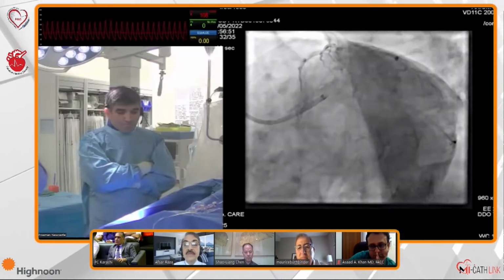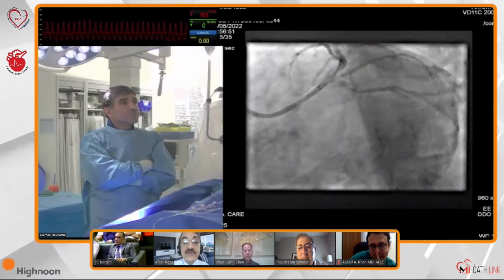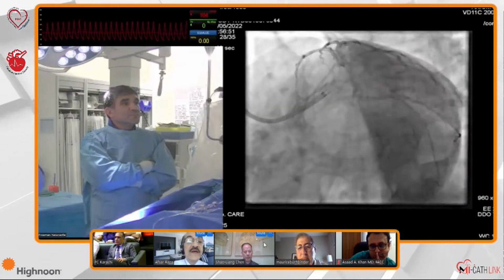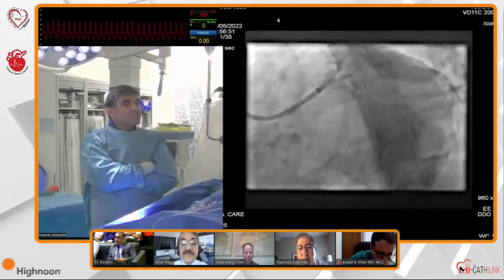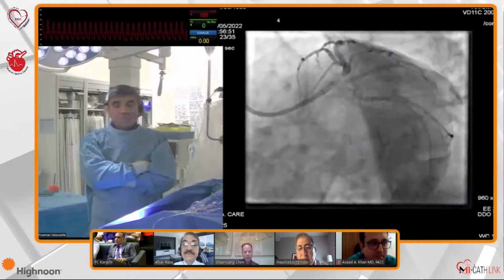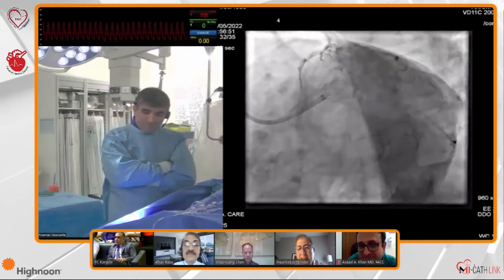Yes. So, okay, we start from our younger consultant colleague from Pakistan. Asad, you have seen the picture, you know the history. How would you approach this patient? Hi, thanks, Dr. Mohanad, for taking time out for Pakistan. So yes, definitely a very complex case.